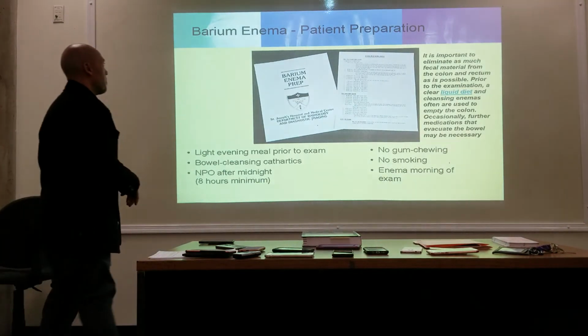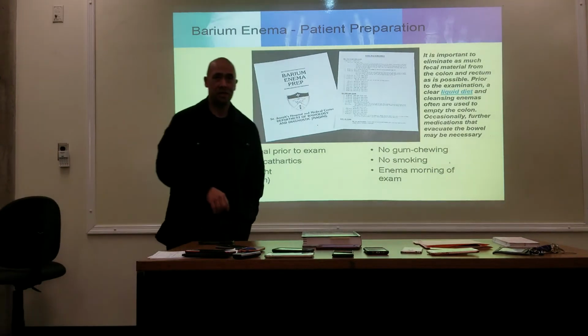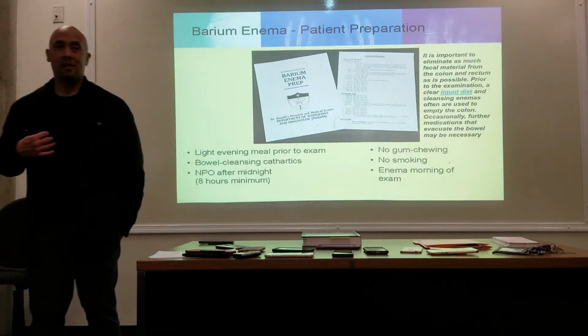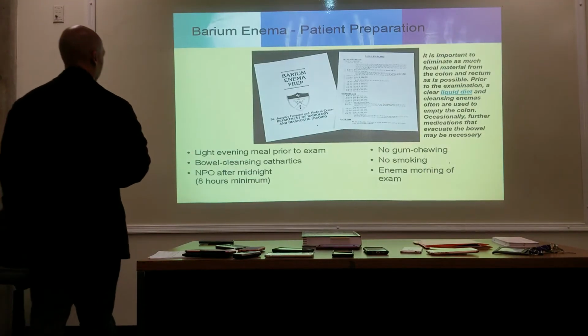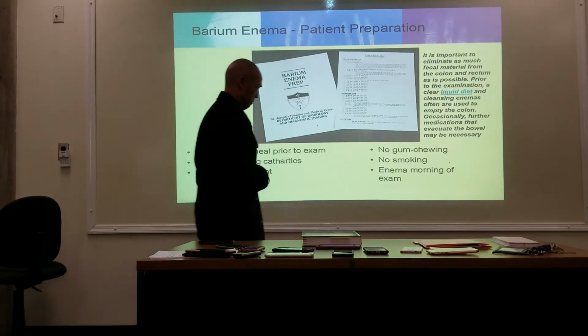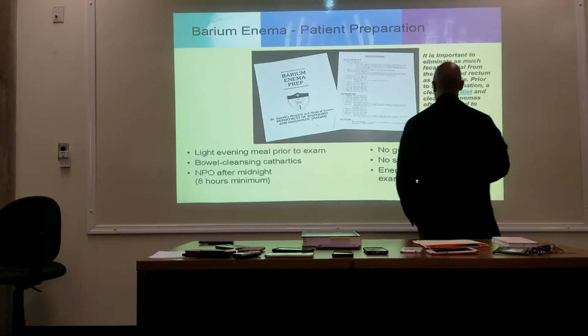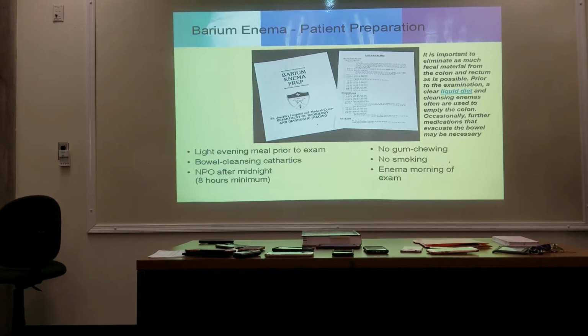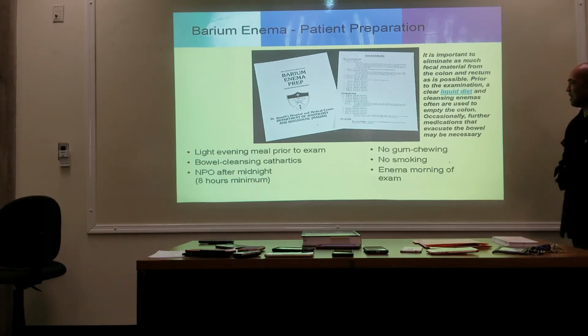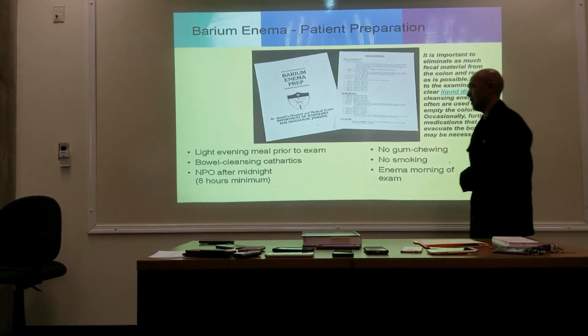All right, so barium enema preparation. What are they? Let's look over here on the far right. It's important to eliminate as much fecal material from the colon and rectum as possible prior to the examination. A clear liquid diet and cleansing enemas are often used to empty the colon. Occasionally, further medications that evacuate the bowel also may be necessary.